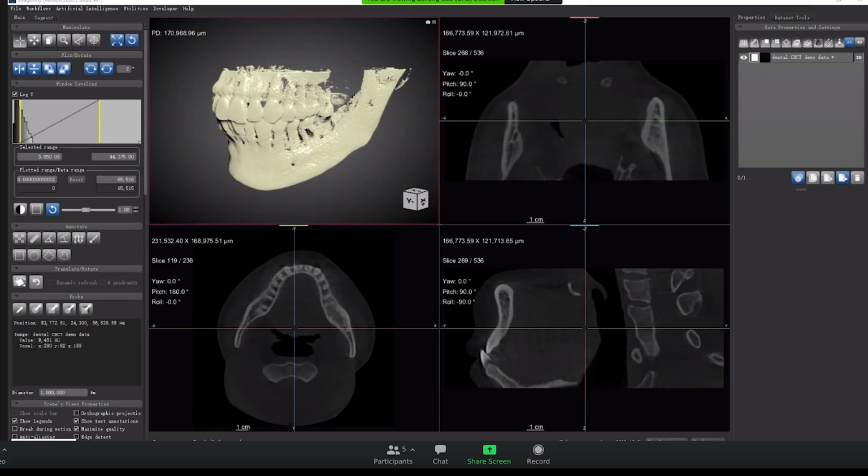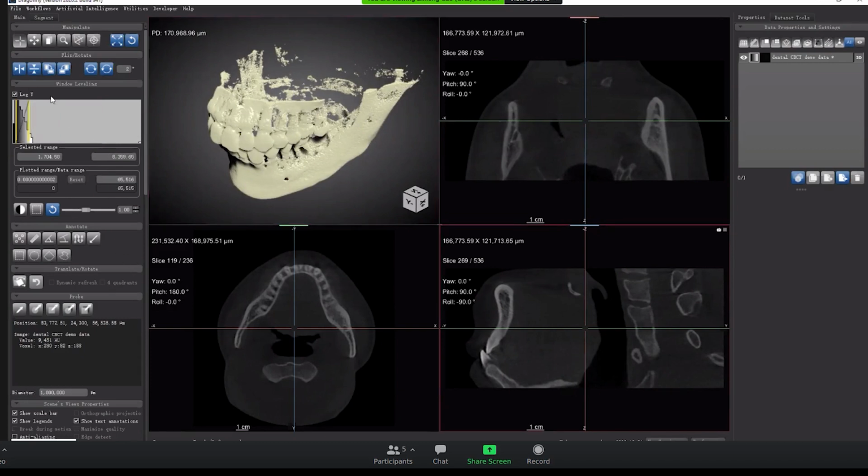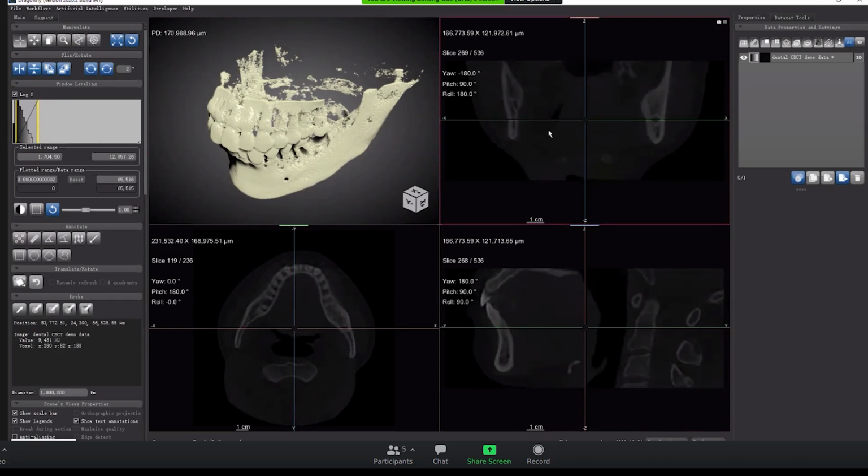Yes. It is a dental CT, cone-beam CBCT data, that I use for this demo. You probably know already how to load it and view the data set in 2D and 3D, so I'm not going to talk too much about that. Just a little thing: by default, it's not using the conventions that medical doctors are used to, so you probably need to flip your view to make it look nicer.